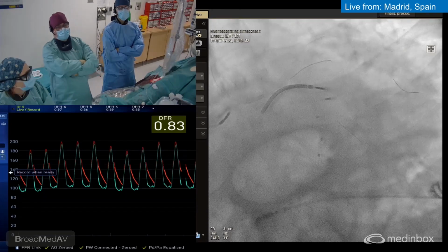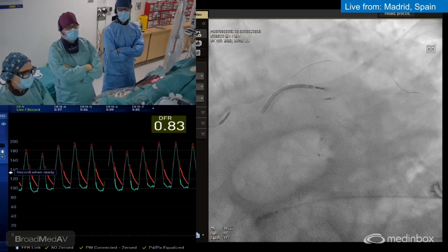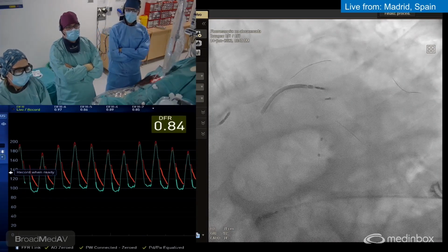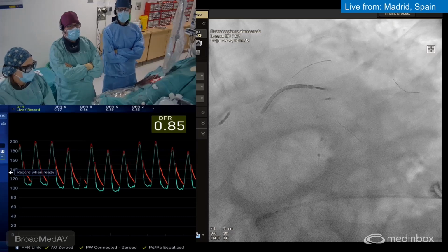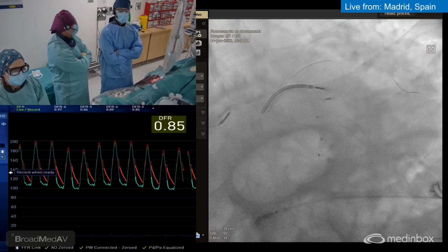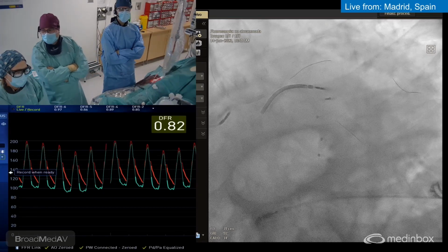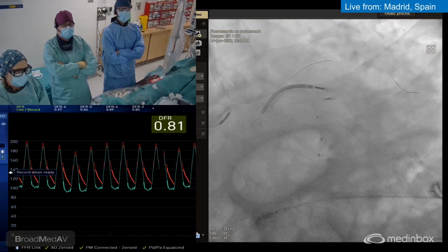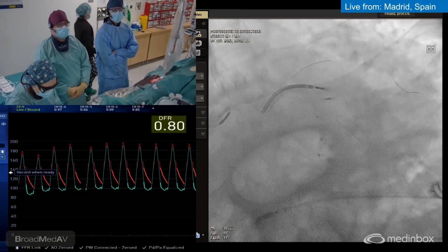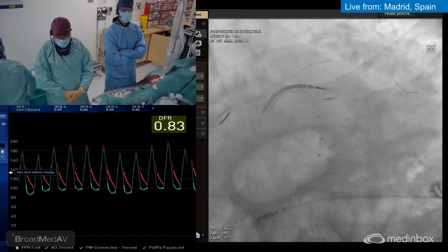Yeah, that's the point, no? I think the ischemia is not critical because we have a value of DFR of 0.83, 0.90, depends what the value is and the threshold. If we do the FFR with adenosine, we can do it. I don't remember, is it that liquid, no? Danny, asthma or something like that. No. ¿Nos podéis dar adenosina intracoronaria, por favor? Guillermo is saying that we can do another measurement with FFR, with intracoronary adenosine.